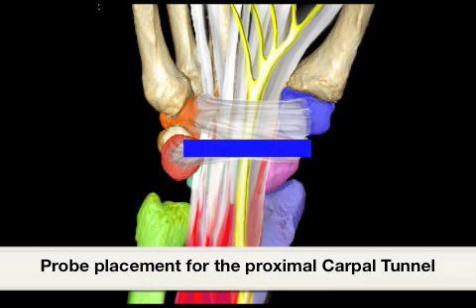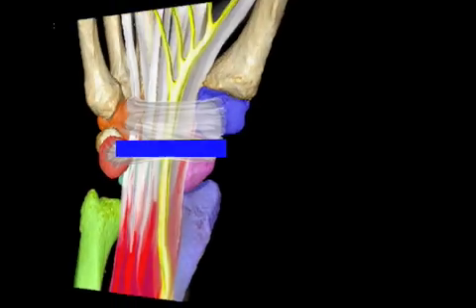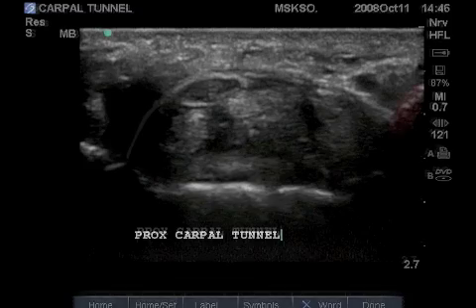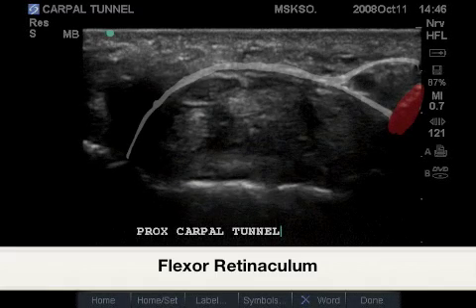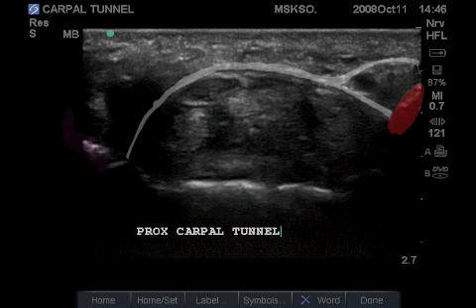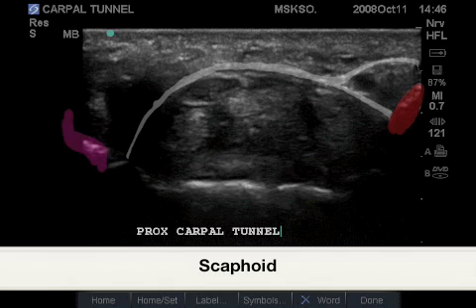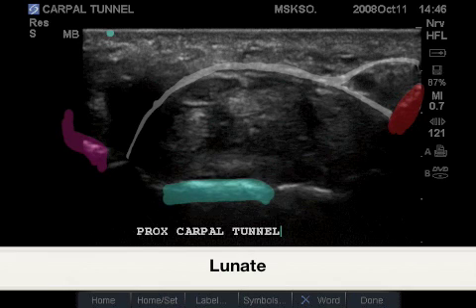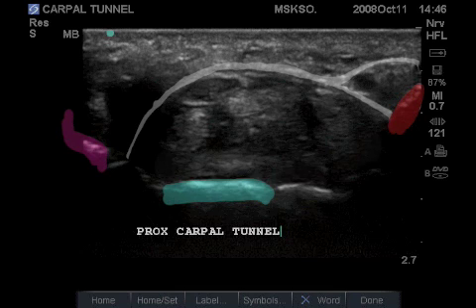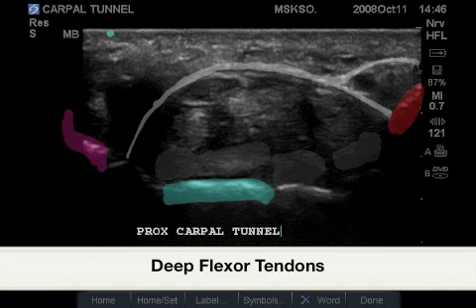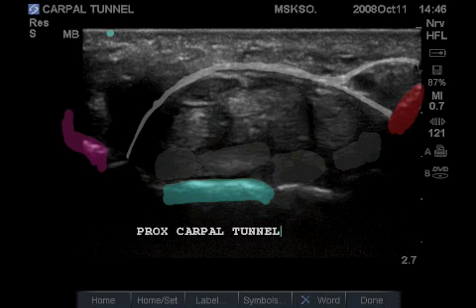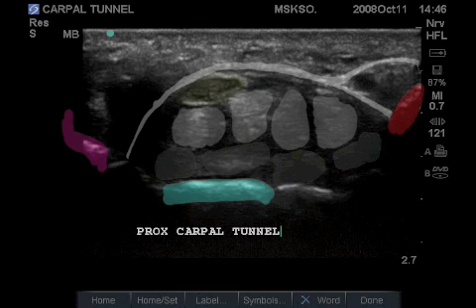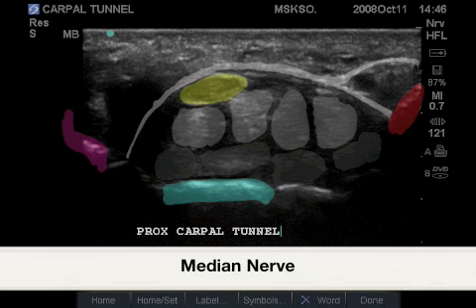Probe placement for the proximal carpal tunnel examination is shown in blue. Here's the corresponding image. Highlighted in white is the actual flexor retinaculum. Highlighted in purple is the scaphoid insertion, in red is the pisiform, and the blue is the lunate surface. In gray are the deep flexor tendons, the white-gray are the superficial flexor tendons, and yellow is the median nerve.